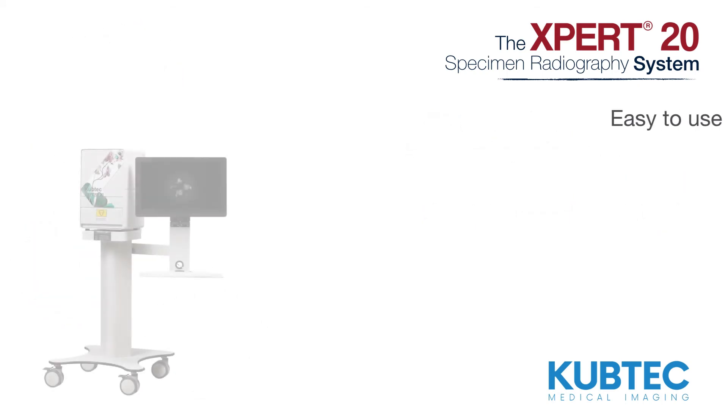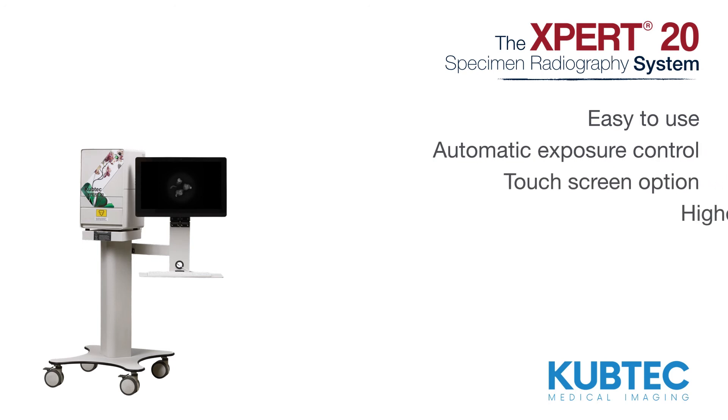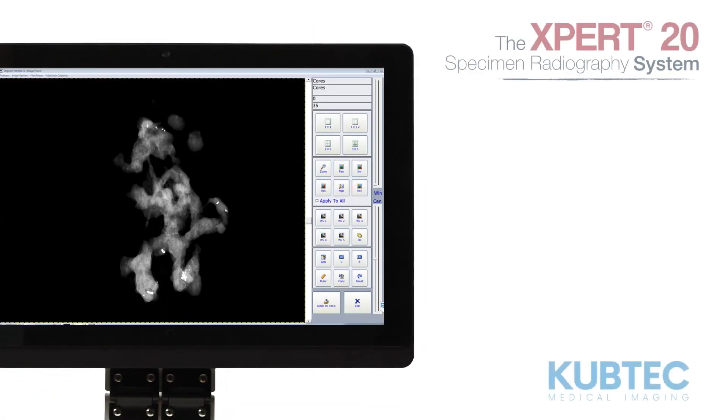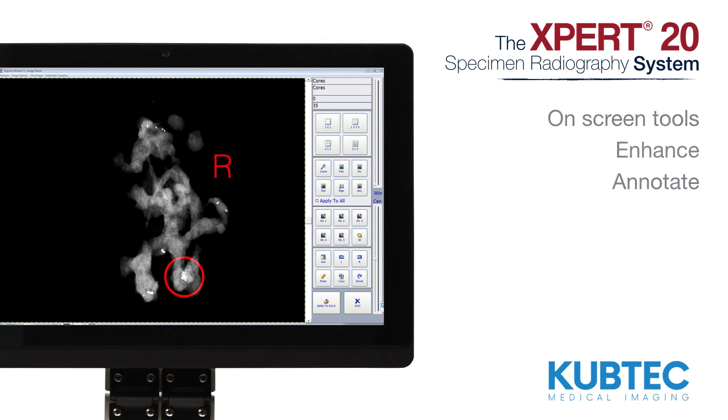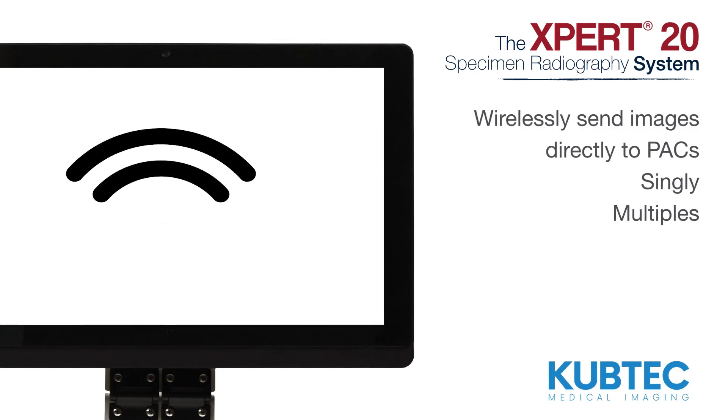The Expert20 system is easy to use. With automatic exposure control and a touch screen option, simply touch a button to get the highest quality images. Use the on-screen tools to enhance and annotate images, and wirelessly send images directly to PACS, singly or in multiples.